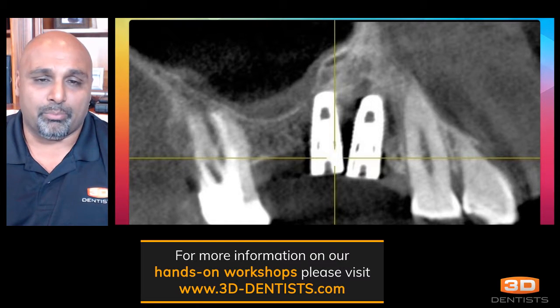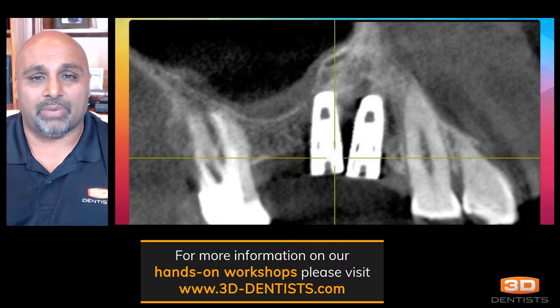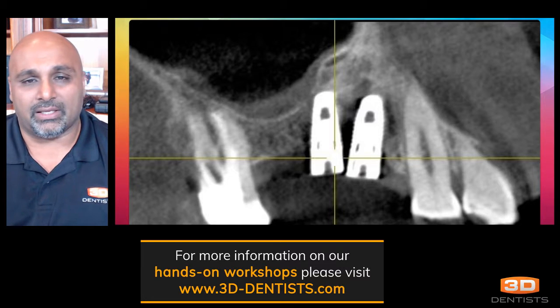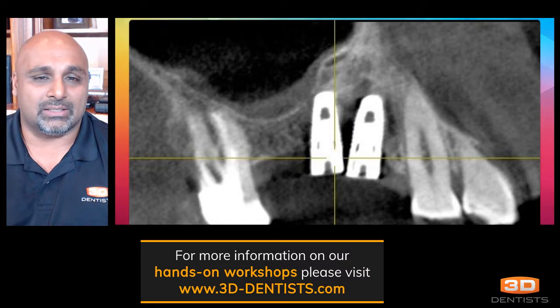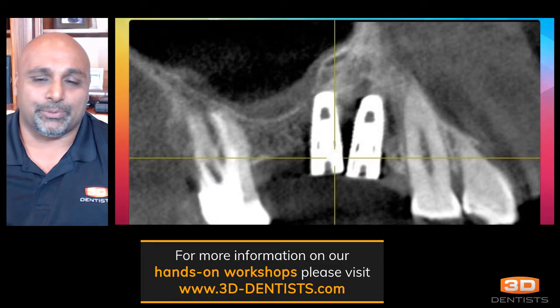So many general dentists, and certainly those who are new to implant dentistry and with 3D imaging, are going to be what I call crutched by having the surgical guide. And certainly I'm that way myself, but I think what we have to realize is that our plan is unbelievably important to be able to create a great result.